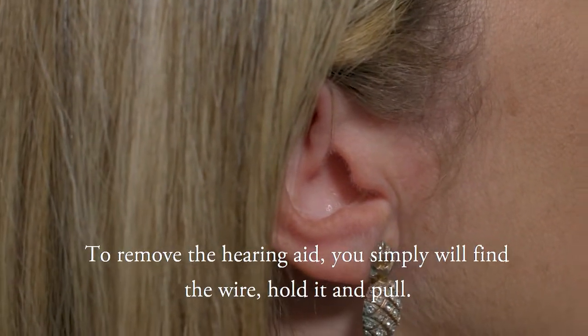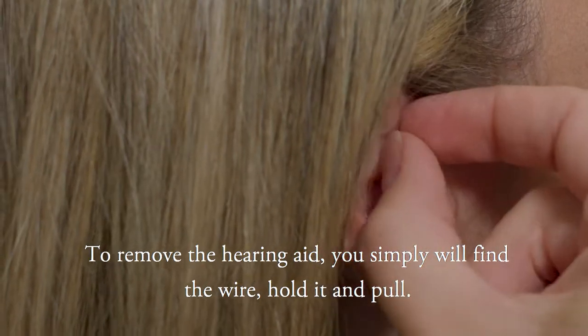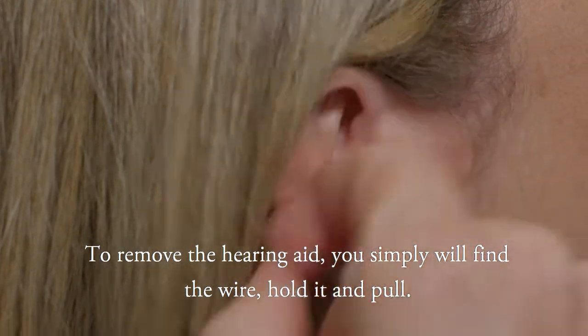To remove the hearing aid, you simply will find the wire, hold it, and pull.